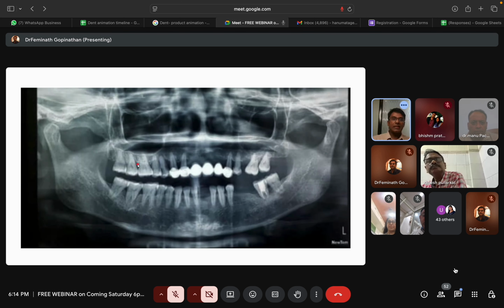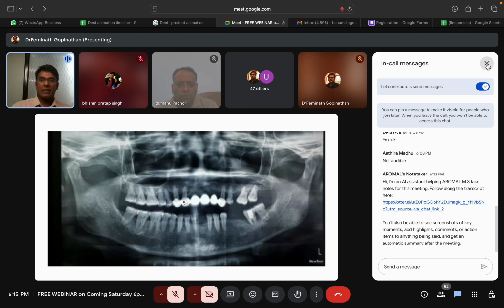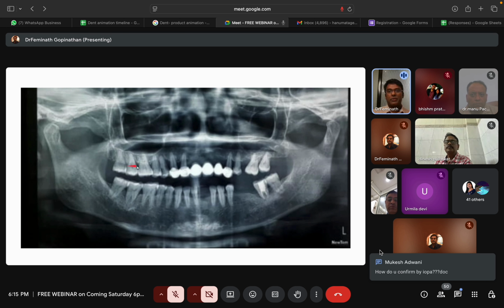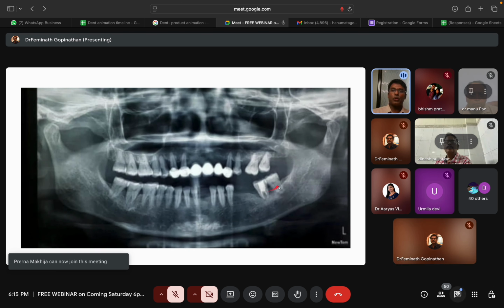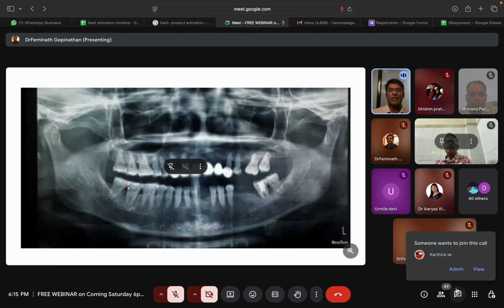See, in this case, if you look at the OPG, you can see that these two teeth are quite stable, but they were mobile clinically, and all this bridge was mobile, and these 2 teeth were also mobile. This area looked stable in the OPG, but I confirmed it from an IOPA and found that this also had a very bad prognosis. So this was converted into a full mouth case in the upper. On the lower, these 2 teeth from the OPG itself were found to have a bad prognosis. So this also was found to have a bad prognosis. So we decided to remove this.